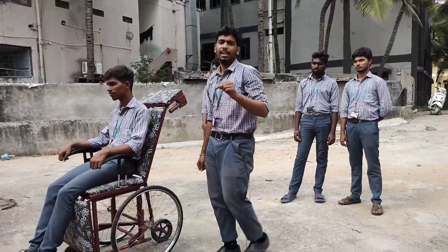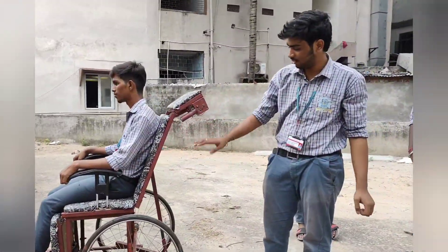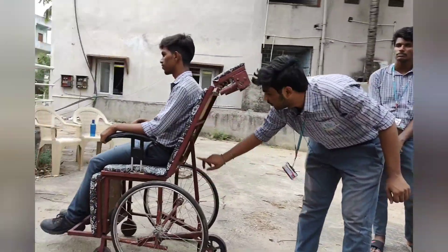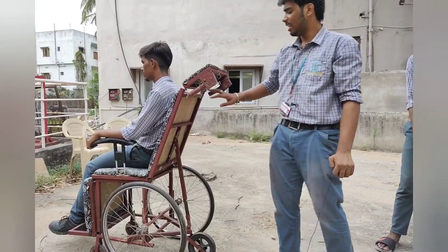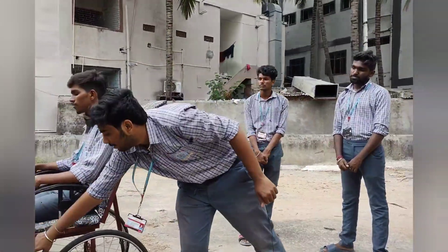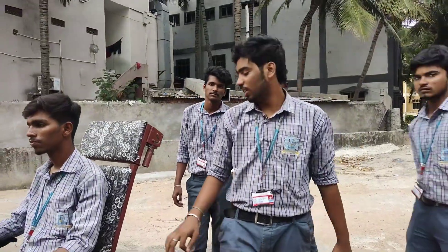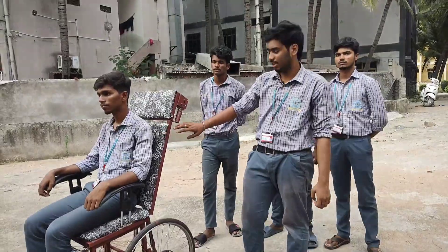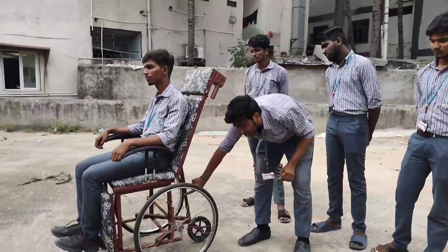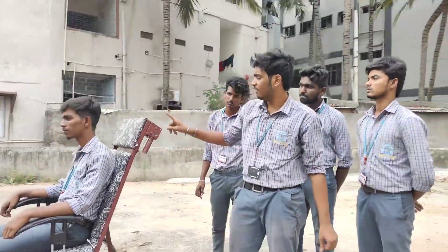We also made a separate linkage so that this wheelchair can be converted into a stretcher. This is the linkage connected to the backrest of the chair, and we have put in a locking system so that the leg rest does not come down when it is in the full chair form. I am going to show how this chair is converted into a stretcher in an easy and comfortable way using this linkage and locking system.